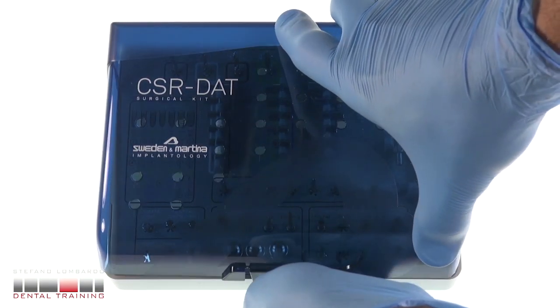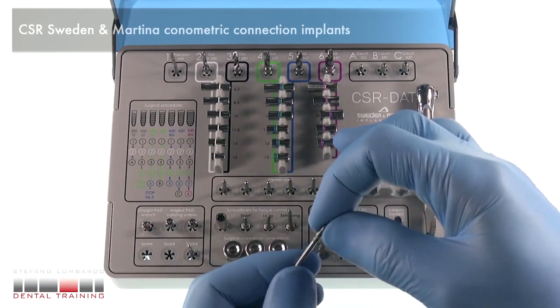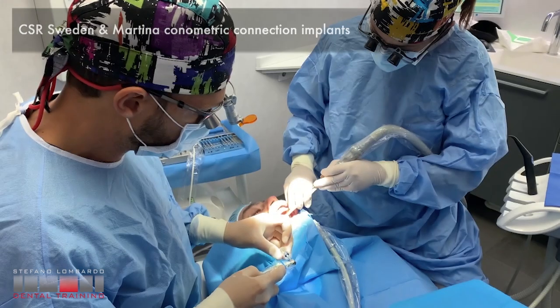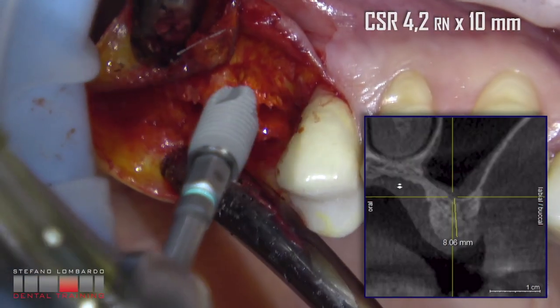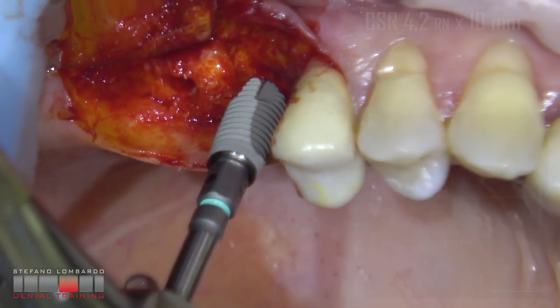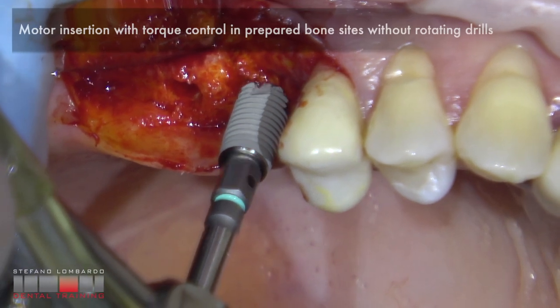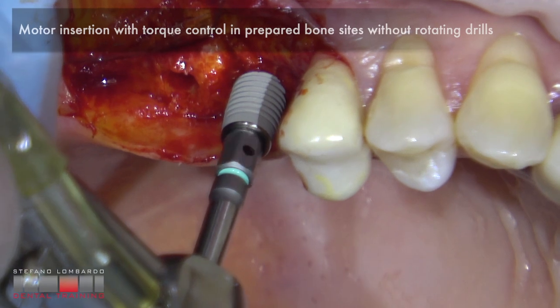CSR by Sweden and Martina — conometric connection implants. Motor insertion with torque control in the prepared bone site, without rotating drills.